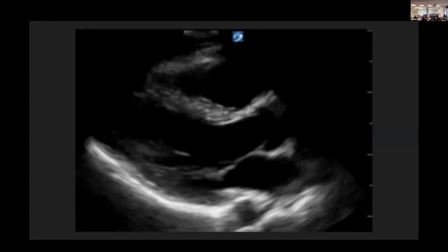So with the parasternal long axis, normally we're looking at the descending aorta, see if there's a dissection flap. We're using the rule of thirds, making sure that the RV is the same size roughly as the aorta, is the same size as the left atrium. And then we're taking a special look at the aortic valve. Sometimes you can throw color on there too, maybe see some regurg. All right, that's what we normally do.